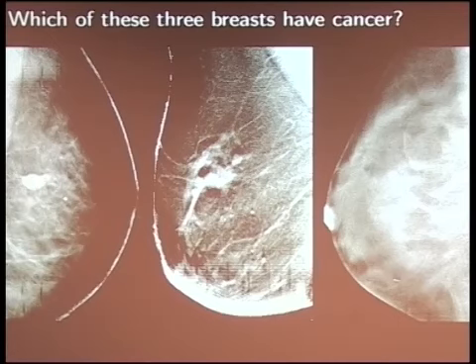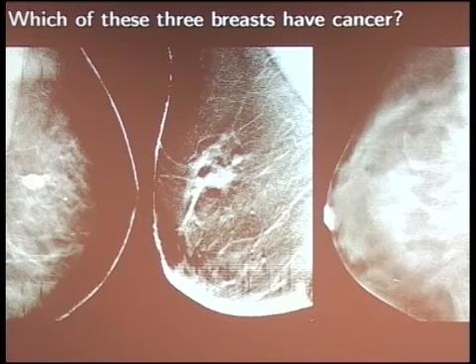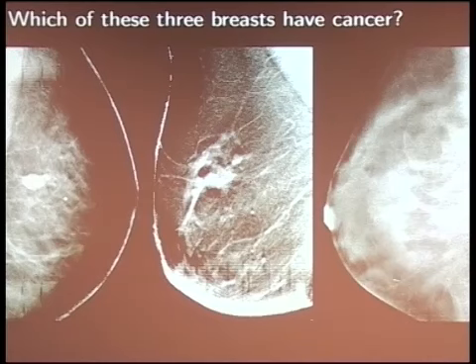And now the question is, is there cancer or not? And as you may know, mammography is a really difficult topic. I mean, radiologists still make mistakes because the cancer and healthy tissue have roughly the same attenuation for X-rays. So cancer is not a white spot or a dark spot. It's a matter of very intricate textures and stuff like that. So is this cancer? Is this? It takes really a long education of radiologists to answer these questions, at least sometimes correctly.